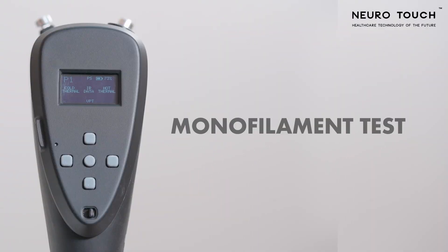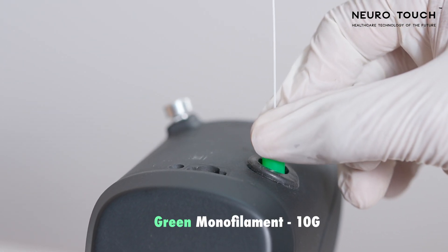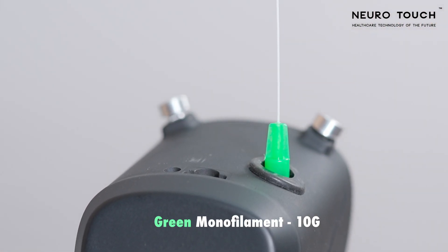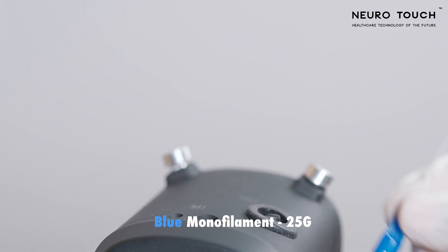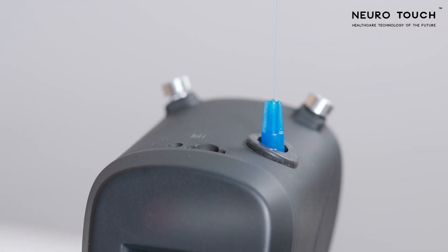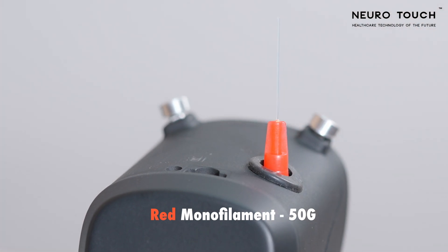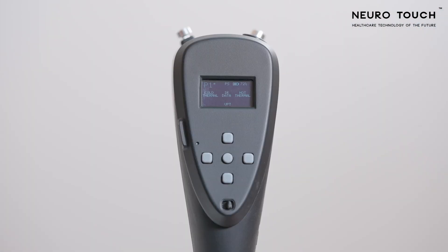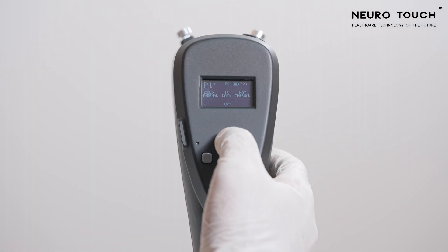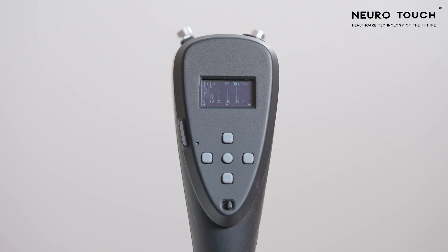Monofilament Test. There are three types of monofilaments. The green monofilament can record pressure up to 10 grams, the blue monofilament can record pressures up to 25 grams, and the red monofilament can record pressure up to 50 grams. Click the up key to start the monofilament test. You can see an empty bar chart on the display.